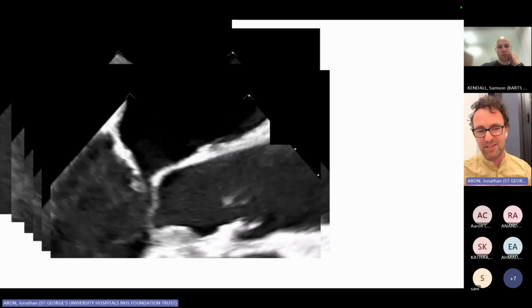Okay, this is very exciting now. So the anterior mitral valve leaflet seems to have completely occluded the left ventricular outflow tract. The aortic valve is still fluttering. But here now, importantly, you can see that this valve's now been ripped open. So if there was color applied here, you'd see mitral regurgitation directed in this direction posteriorly, because it's TOE, it's the wrong way around.